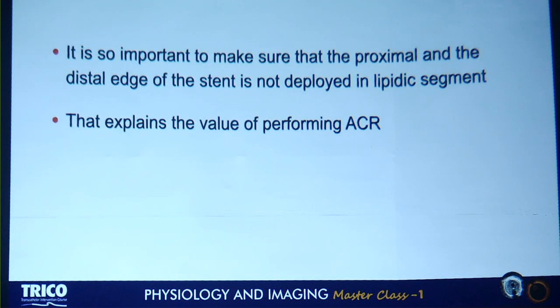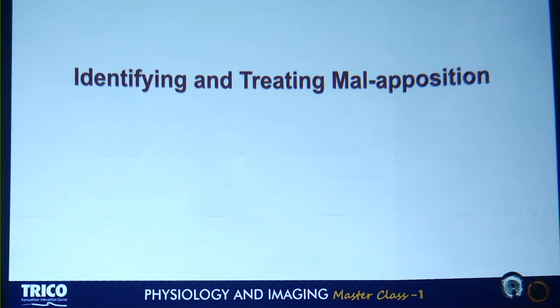And in the afternoon, we are going to have one case of stent edge ISR, and we will discuss in depth the different types of ISR, the different varieties, how you identify them, and what is the impact on the treatment. So it is so important to make sure that the proximal and distal landing zones, the edge of the stent, are not deployed in a lipidic segment, and this explains the value of performing angio core registration.